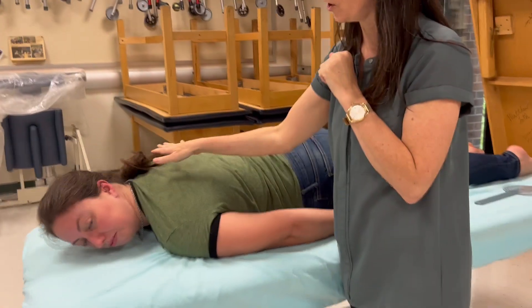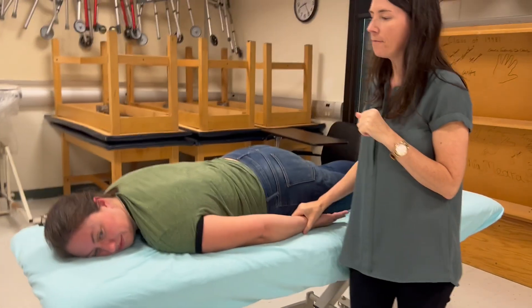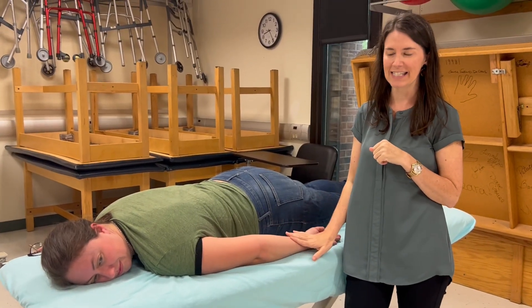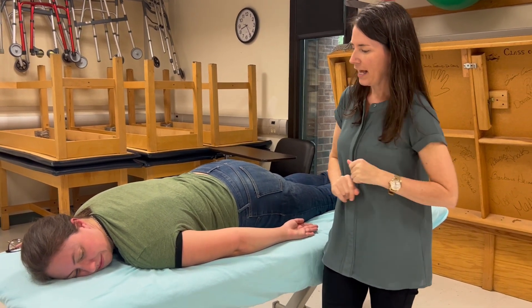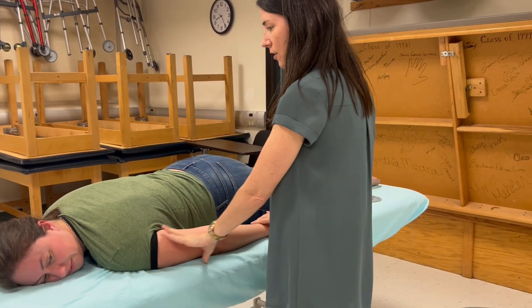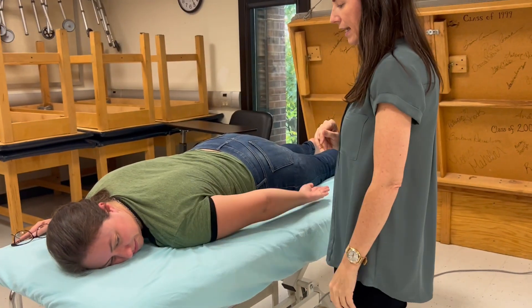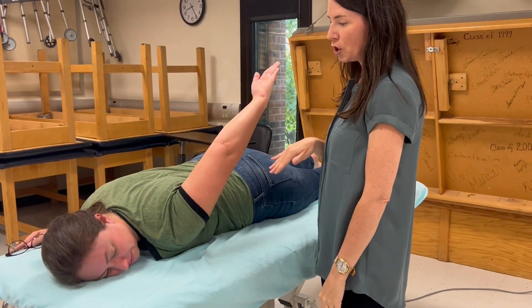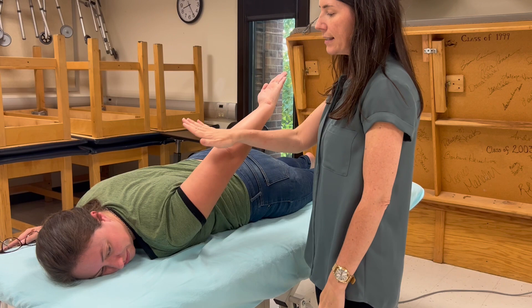Instead of the palm facing the body, the palm faces the ceiling. I'm going to have you keep everything straight and bring it away from the bed again as high as you can — I'm going to try to push you back down and you're not going to let me do it.